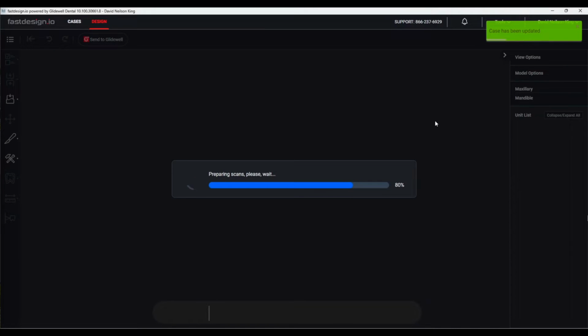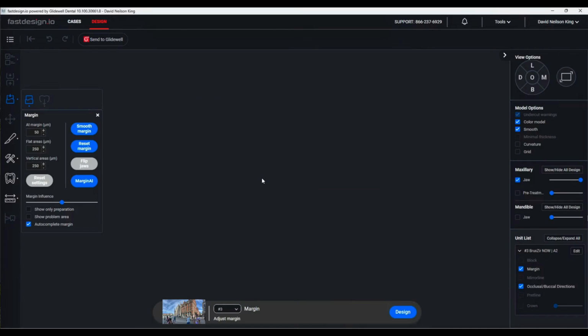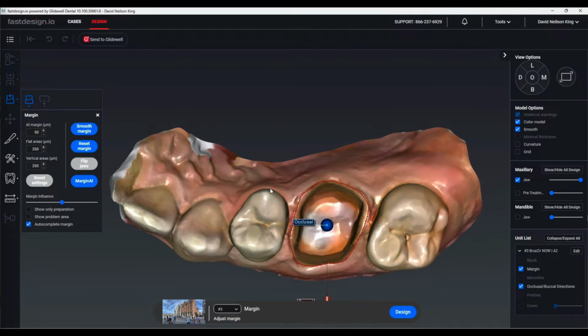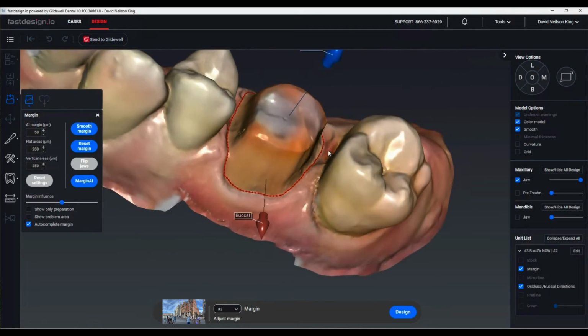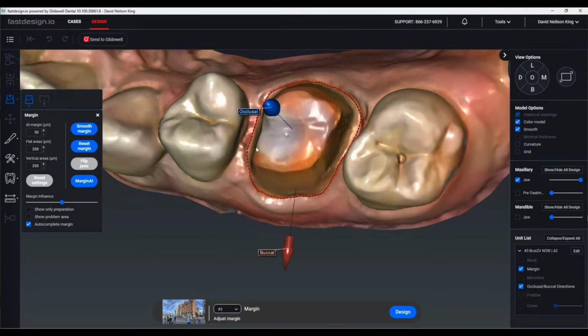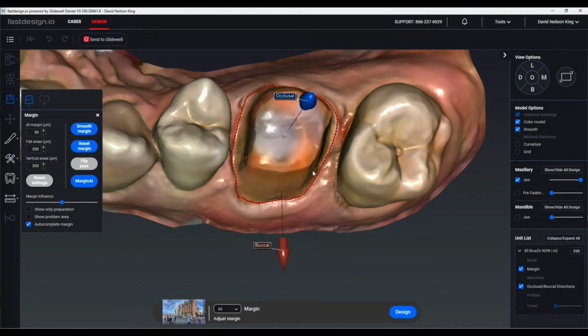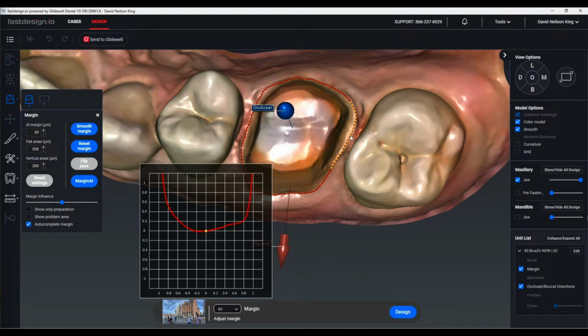And this will probably propose a margin, and what I'll need to do is design it, or do the margin, and then take it back to the restoration copy design up here. So it's computing the margin AI, and here's where you get to see if you've got a good prep or a bad prep. Generally, I try to make the nicest, smoothest preps possible. So you can see we got a little bit of disturbed area, some roughness there. If it's really minor, I just ignore it. If there are big divots, I'll tend to try to smooth that using this tool over here, the scan repair tool. But let's get the margins fixed up.